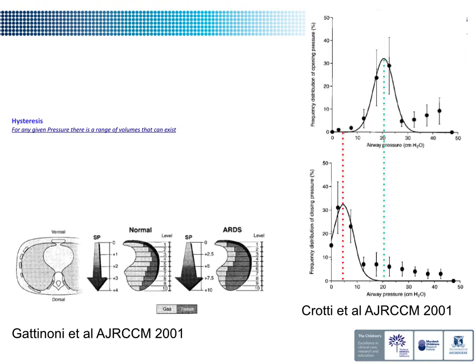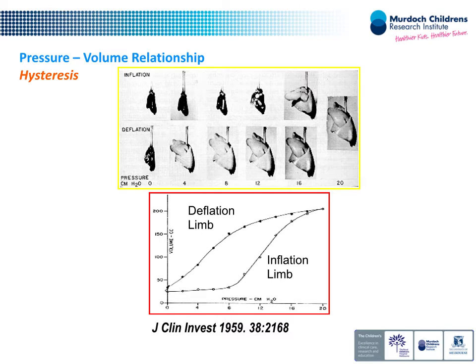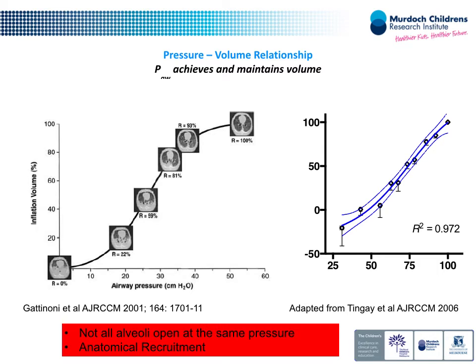Can I ask you? Yeah. On the previous slide, or even in this one, you are looking at a very friendly lung where the compliance, or the point that you are able to inflate, is more homogeneous. This is a very unfriendly lung, I would put it to you. No, this is not the lung that we're ventilating with a baby.